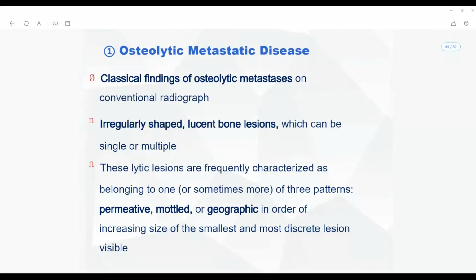But in the lytic lesion, the black area in the multiple myeloma patient is actually destroyed bone. But the black area in the case of Paget's disease is the one that is normal. Yes, right? Such confusing questions are quite famous in Indian examinations.